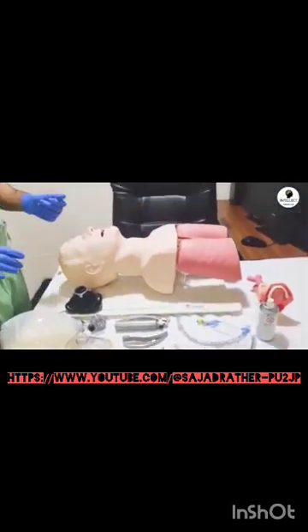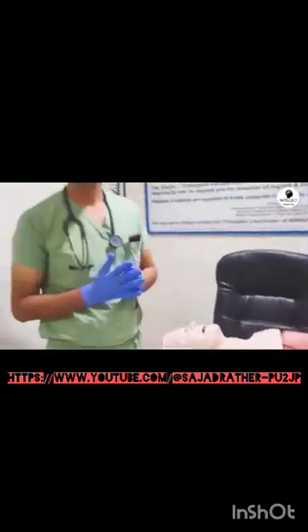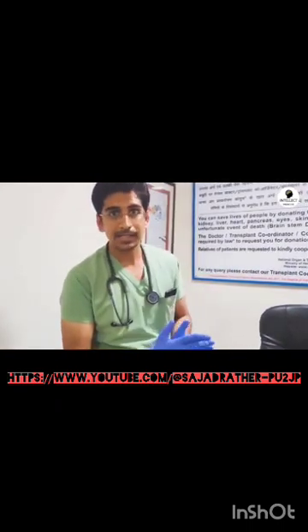Coming on to the procedure, how to perform it. First of all, you need to have all the universal precautions. That means you need to wear gloves and a mask. And now we are working in this COVID era, so we need to wear a mask. That is mandatory. Before performing any kind of procedure, before intubating or even bag and masking, you need to have your mask, right?